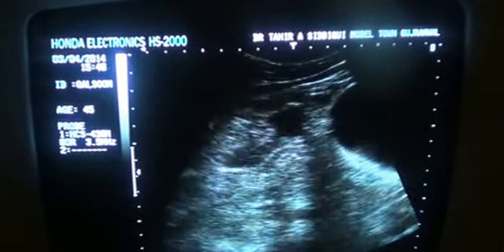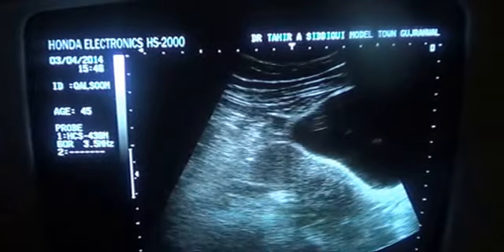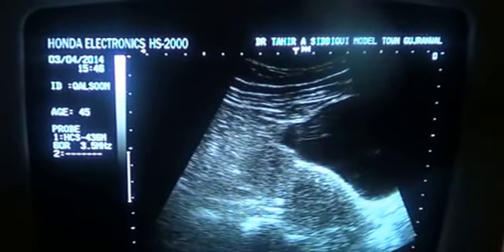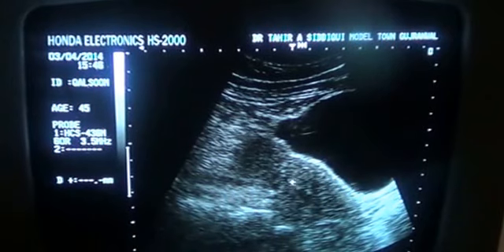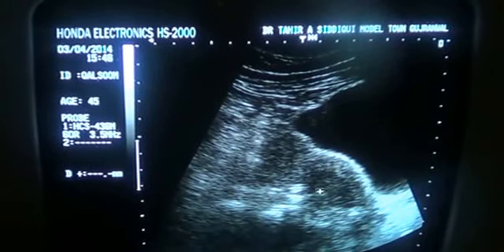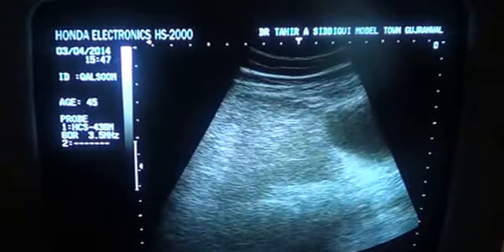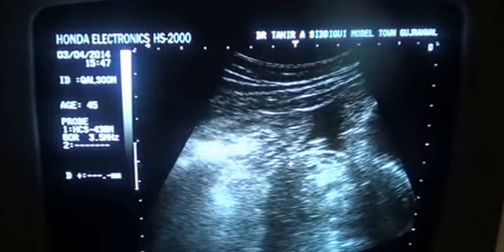And as I move the probe towards the left adnexa, the menopausal uterus is fine, no problem. It has started developing fine, tiny calcifications in the upper edge of the myometrium. So this is the normal uterus, otherwise with a small subserosal fibroid. And now as I move the probe towards the right adnexa, you can see free fluid. This is the free fluid.